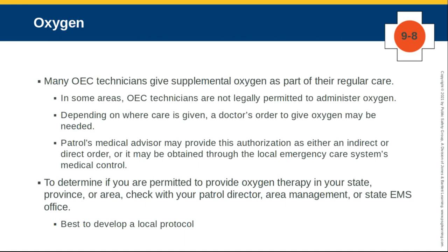Now, in some areas, you may not be permitted to administer oxygen, but it's part of our standard of training for OEC. In this case, make sure that you're aware of your local protocols, and this will come from your patrol's medical advisor.